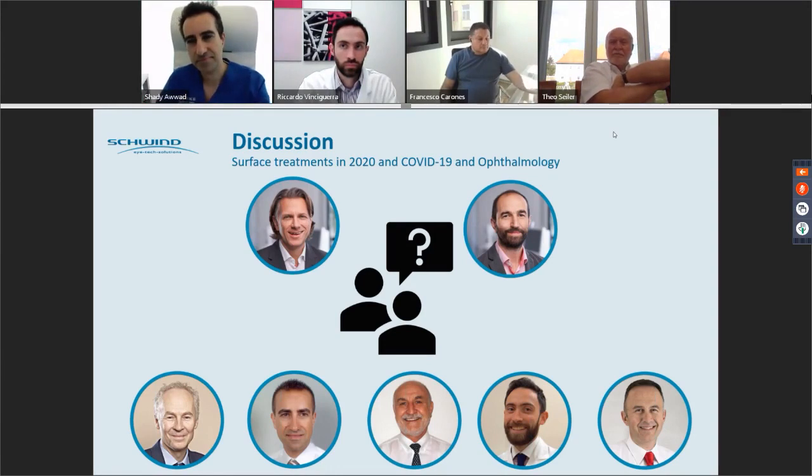Yes, and Shady, in such cases, we still have add-on lenses of IOLs. So if you push somebody into myopia due to your hyperopia treatment, which you have to do to enlarge the optical zone, you still can add a -2 or -3 add-on. So the patient should be happy with the better optics and having then the add-on. So thank you very much indeed for this great discussion.